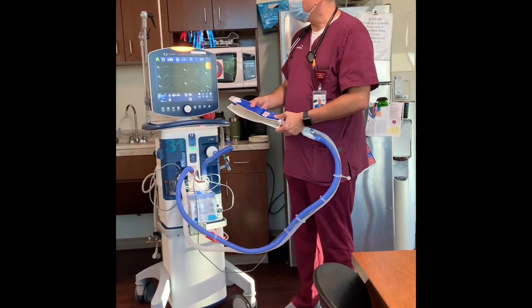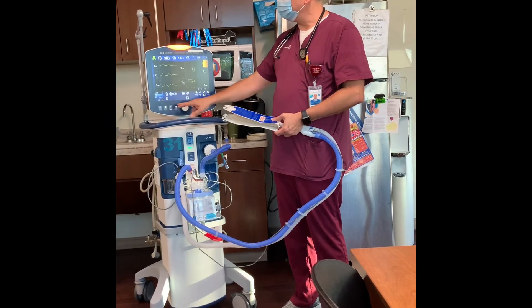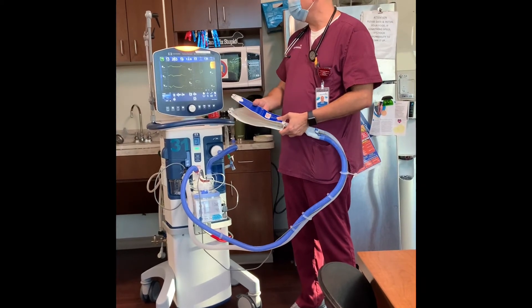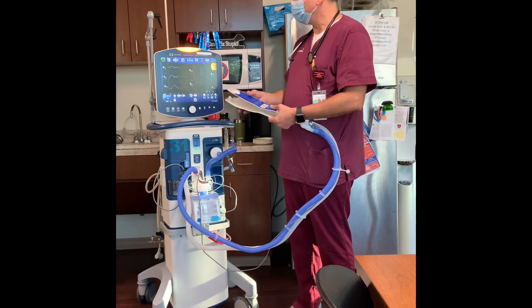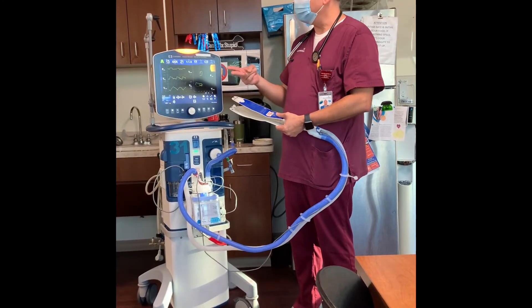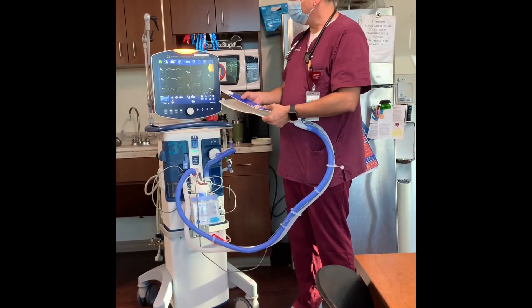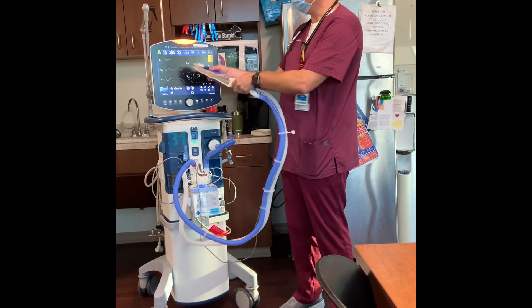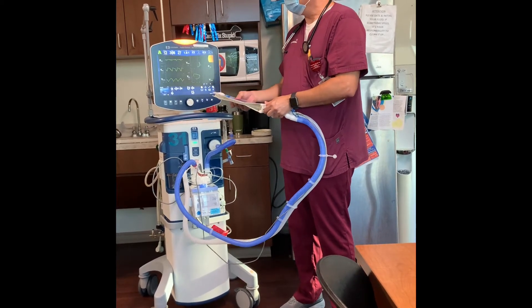Just as a review: this patient is on assist control, rate of 16, tidal volume 420, 100% oxygen, and 5 of PEEP. Now let's talk about alarms. There are three types of alarms on this ventilator: low priority, medium priority, and high priority.